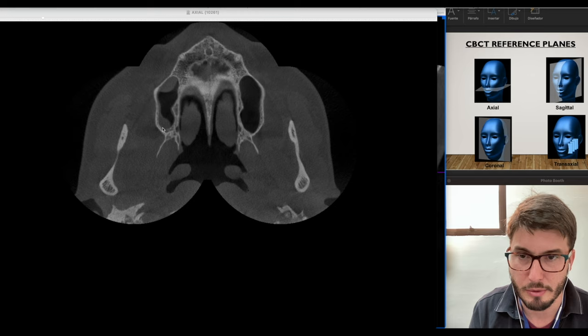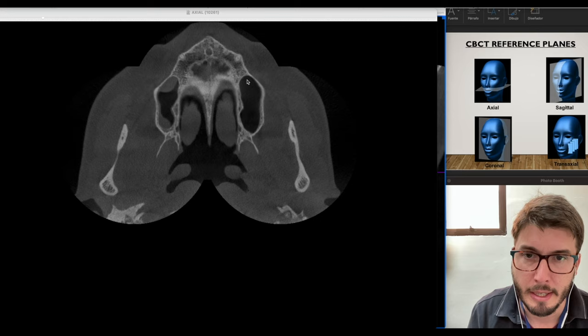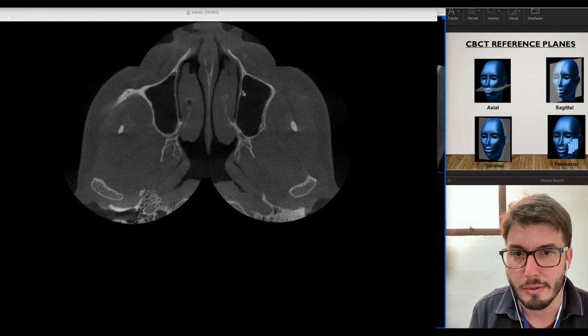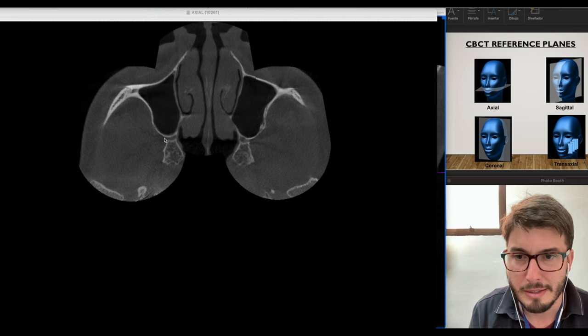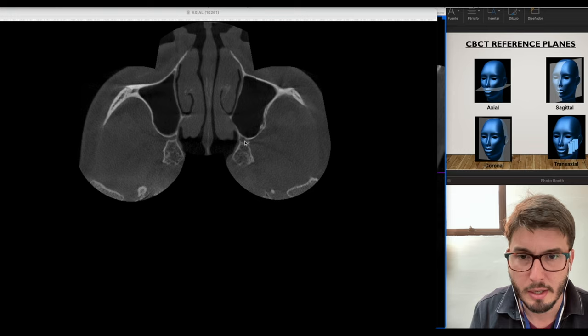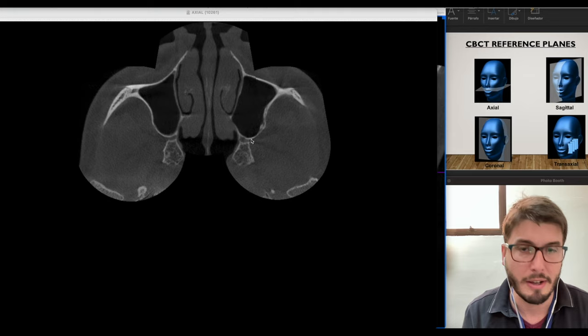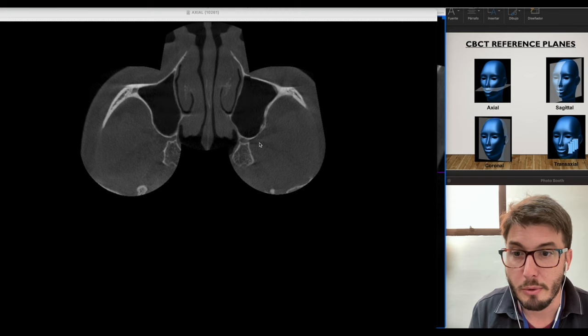Continuing upward, we see the extension of the maxillary sinus, and now the zygomatic bone and the zygomatic arch. The posterior wall of the maxillary sinus is basically the contour of the pterygopalatine fossa, where we have the maxillary nerve giving branches — the zygomatic nerve and the posterior superior alveolar nerve.